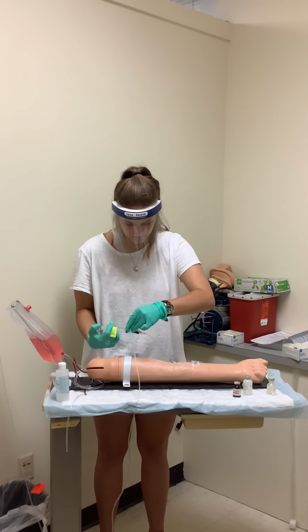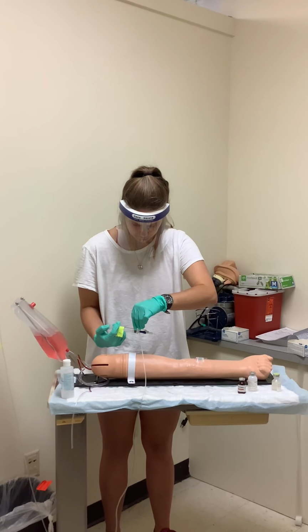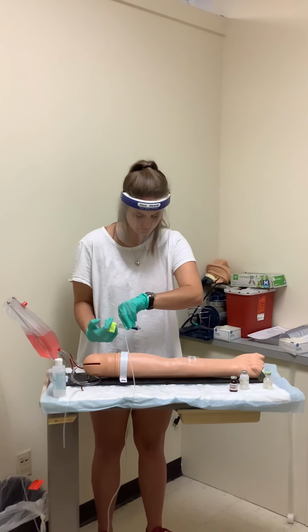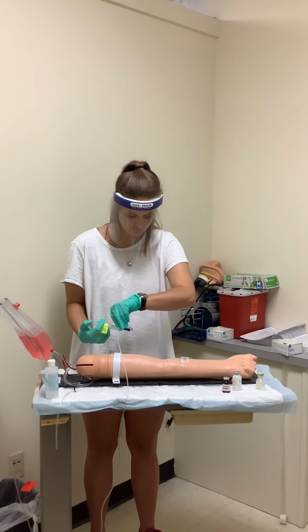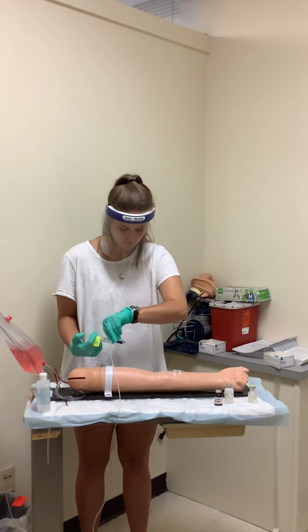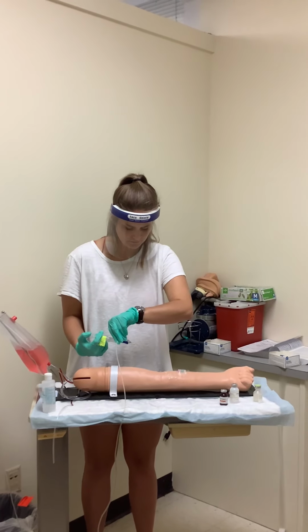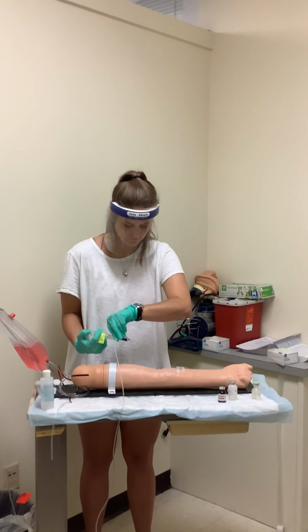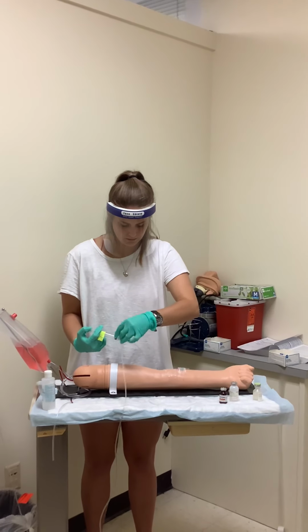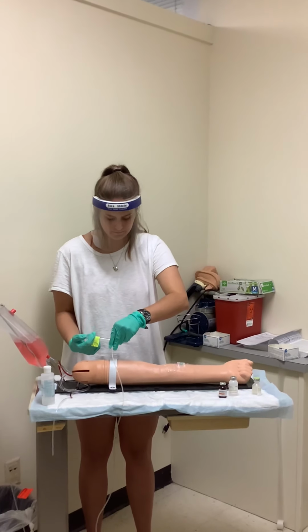I will pinch and give my third and let it go. Pinch, give my last milliliter, and let it go.